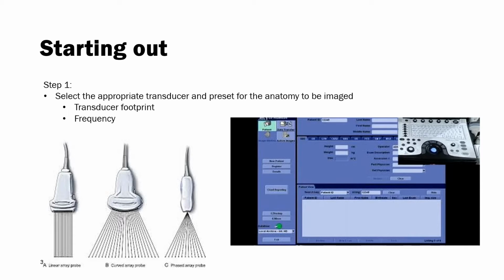So when you're selecting transducer type, a couple things really matter, and that's mainly the frequency of the transducer. So we know that if we're trying to image something that has a low depth and we want really good resolution, then we might go with something like our linear probe that has a higher frequency. If we need something that is going to have more penetration and we're going to have to trade some resolution to get the penetration that we need, we're going to go with a moderate or lower range curvilinear.